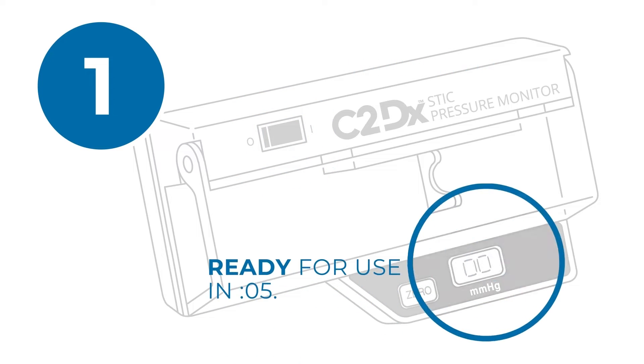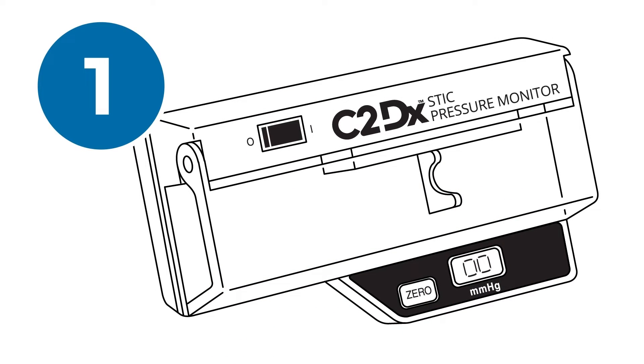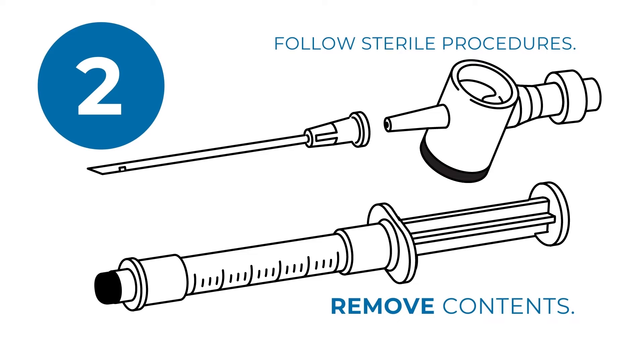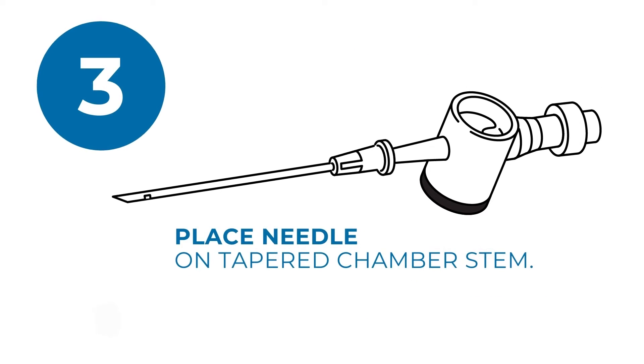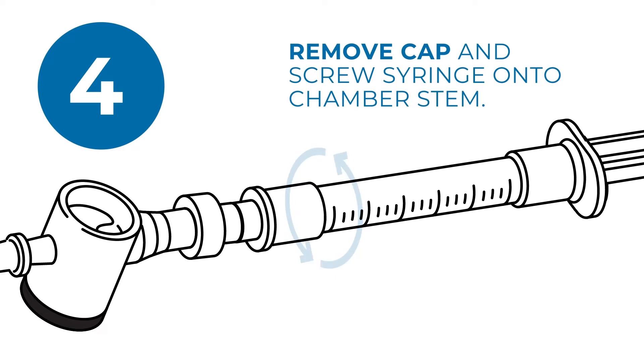Turn the unit on. The stick is ready for use in 5 seconds. Using sterile procedures, remove the contents of the disposable pouch and place the needle firmly on the tapered chamber stem. Now remove the cap on the pre-filled syringe and screw the syringe onto the chamber stem.